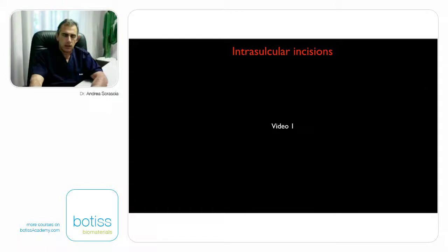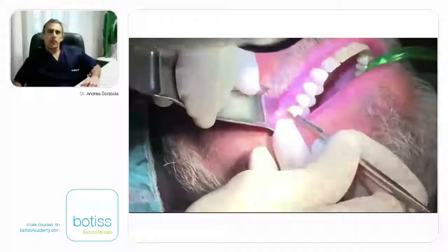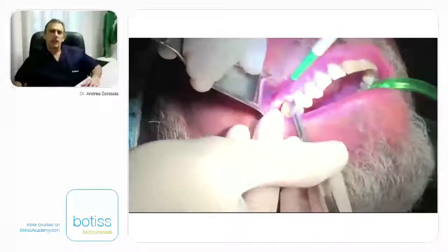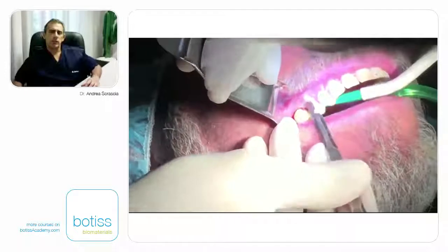This is a short video, a specific case. I had to execute an extraction of the second premolar on the top right side for an endodontic failure.